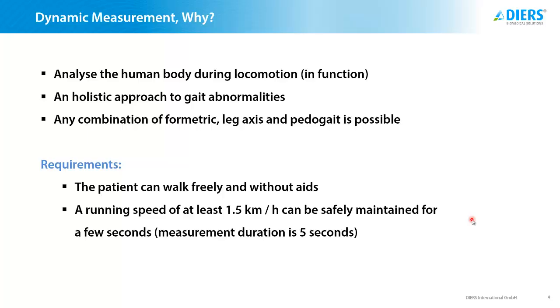Now, how to select speeds and stuff like that will be discussed later on. But as I said, it is important that you make sure that you get a natural walking pattern or running pattern, which only works if the person is accommodated to the treadmill itself.